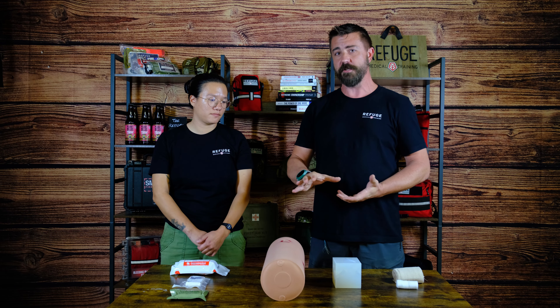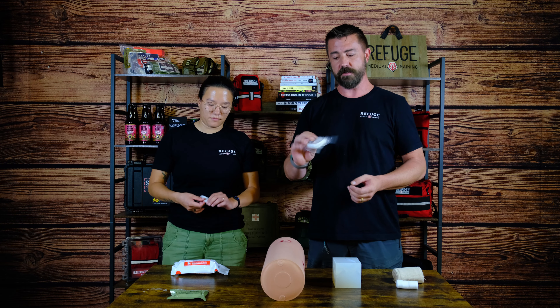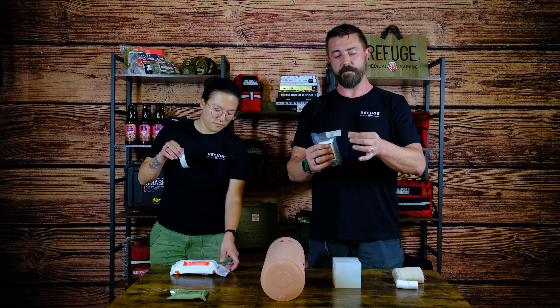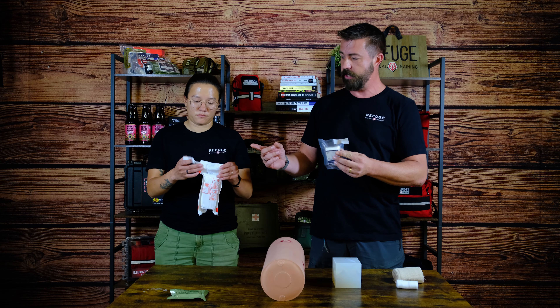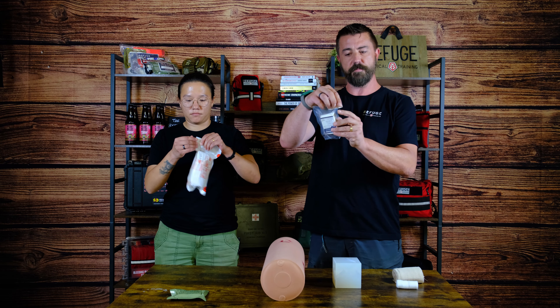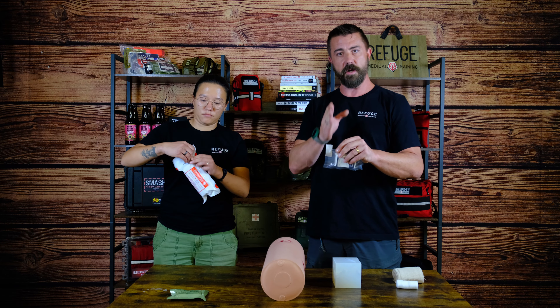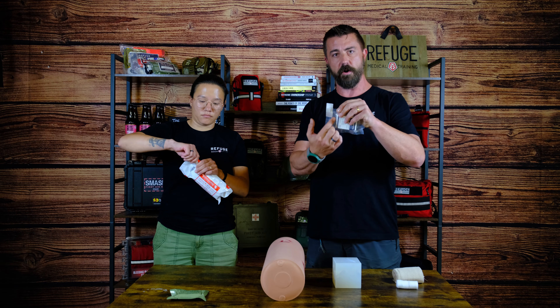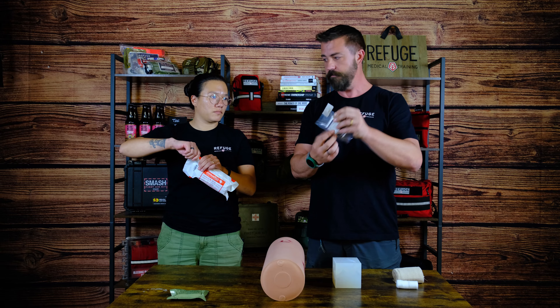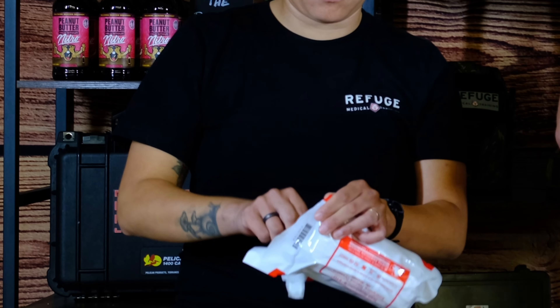One of the first things you may want to do is actually pre-stage your gear. With this package of compressed gauze, I've already applied tape to the edge. You can take a piece of medical tape, duct tape, anything like that, and place it just above the machine-made notch. If that notch is not super sharp, you may want to cut it with a knife, but don't penetrate all the way into the sealed area. That makes it much easier to tear open.